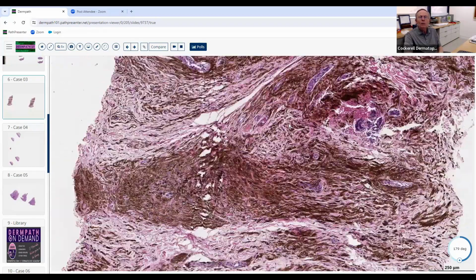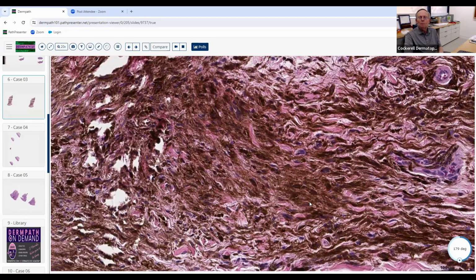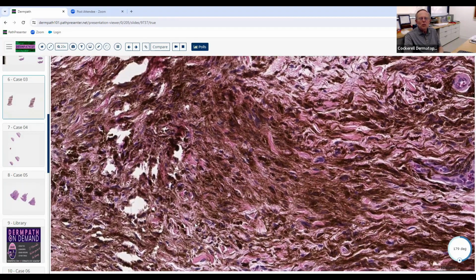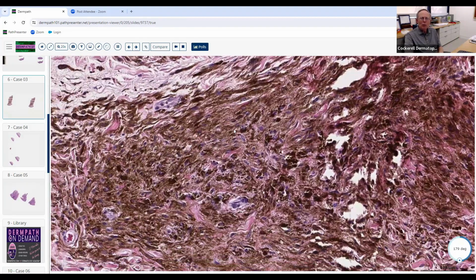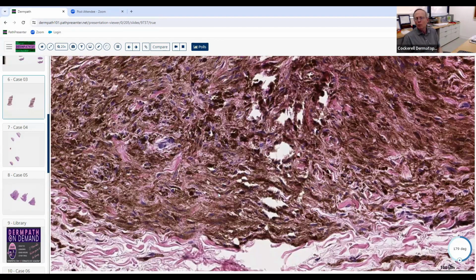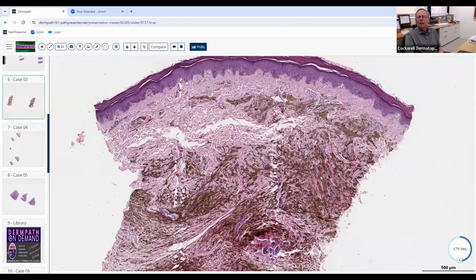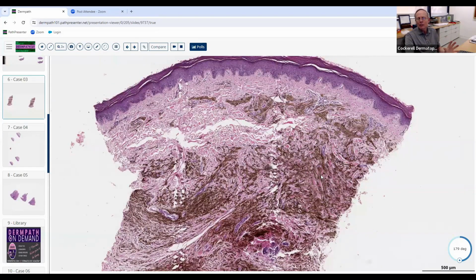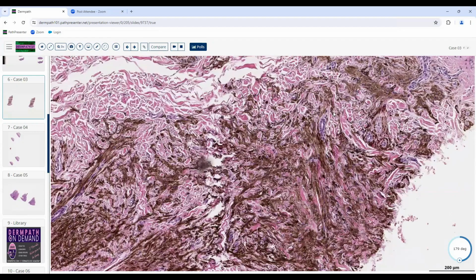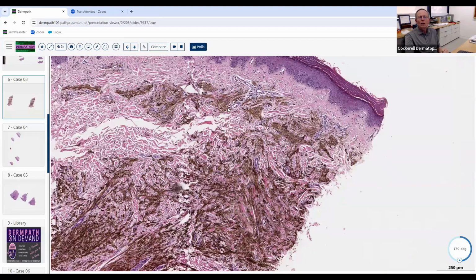But this does have features of the cells that are characteristic of this entity here. So you pointed out they're kind of dendritic and somewhat spindle in some areas. I'm not sure they're as epithelioid, and they're also probably not going to get into pigmented epithelioid melanocytoma and that kind of stuff. That's too complicated. So if I showed you something like this, I want you to think it looks more like a cellular blue nevus or blue nevus. It doesn't have epidermal involvement. It's got the spindle cell morphology, the dendritic cells. So this is a variant of blue nevus.